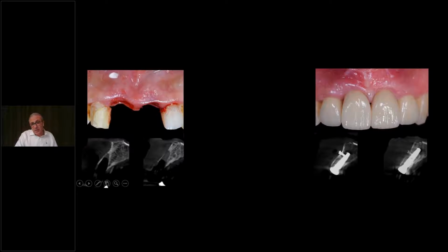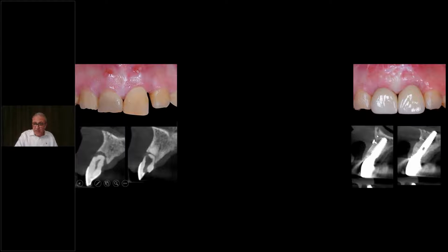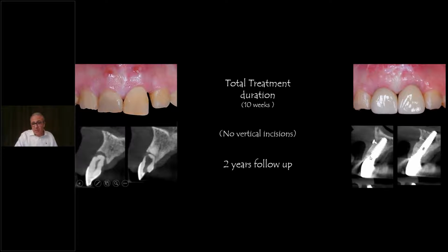Also, thin cases, complete thin tissue with very thin or absent labial plate bone, and we move this case forward to this with this type of bone graft, this type of regeneration in just 10 weeks' time with 2 years follow-up. Two central incisors for a lady who is 35 years old with no labial plate of bone, with active infection, and we move it here into this abundant labial plate of bone thickness at the same 2-year follow-up period.